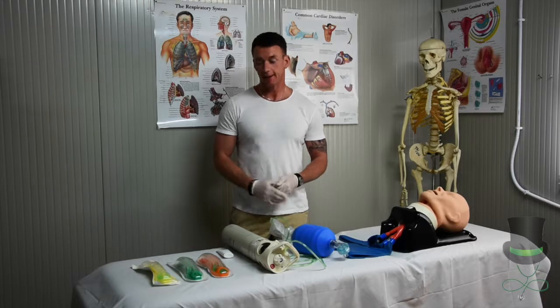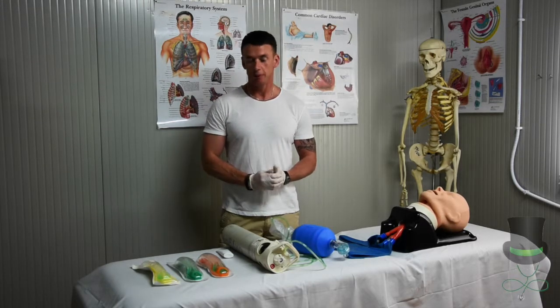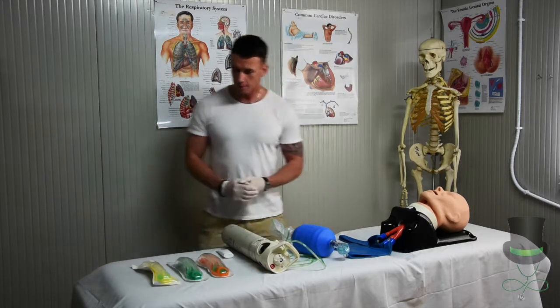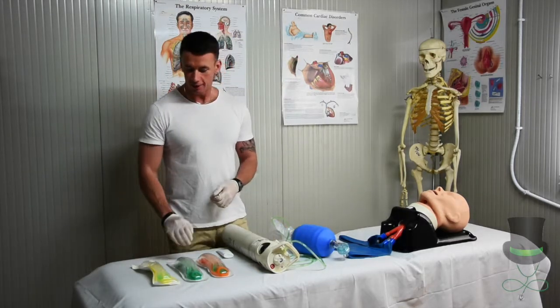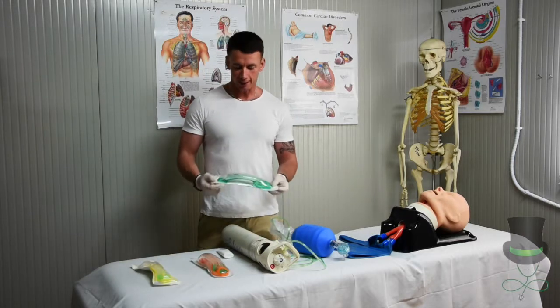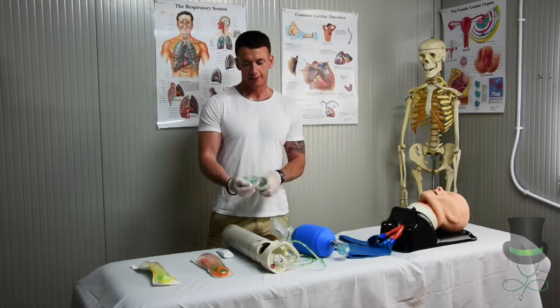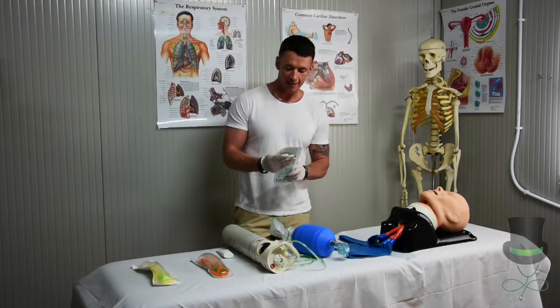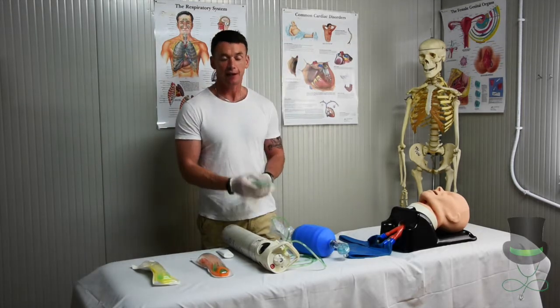Hi, I'm Anthony and I'm a paramedic, and today I'm going to demonstrate to you the use of a laryngeal mask airway. First thing we do is select the size that we want and remove it from its protective packaging. For the purpose of this lesson, I'm going to select a size 4, which is weight-based for a patient between 50 and 90 kg.